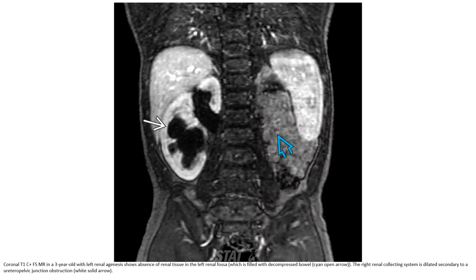This is a CT with contrast in a senior patient with left renal agenesis. There is absent renal tissue in the left renal fossa. The right renal collecting system is dilated, consistent with ureteropelvic junction obstruction.